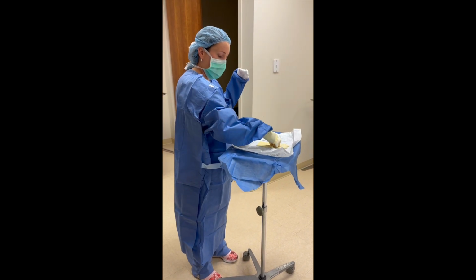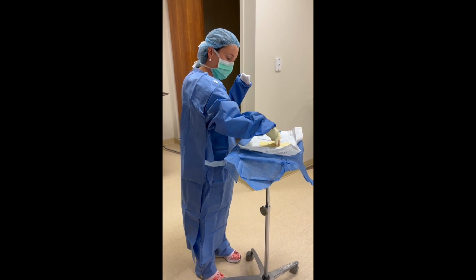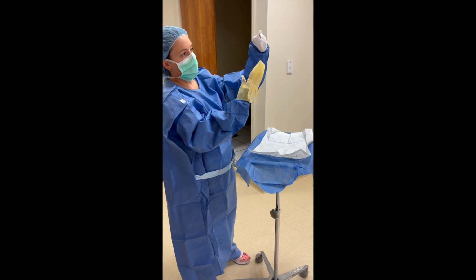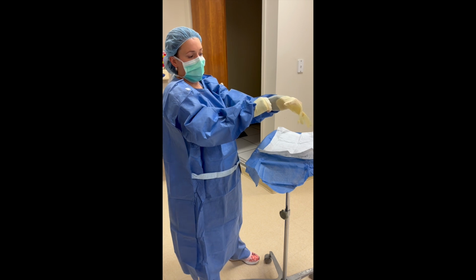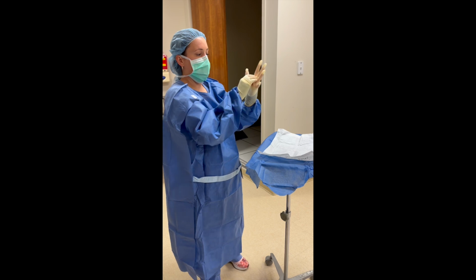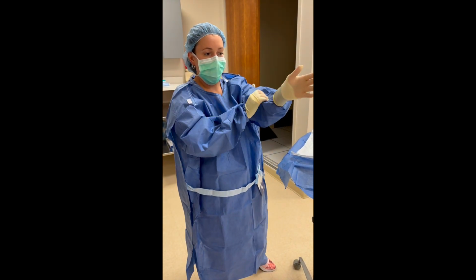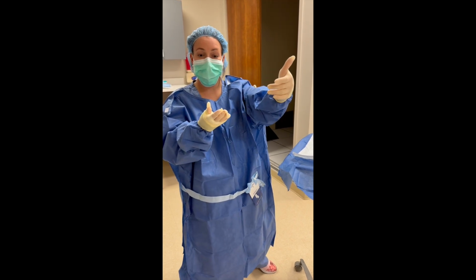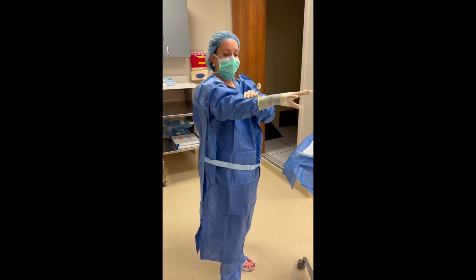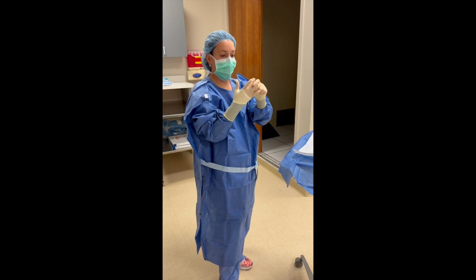So I put my fingers in the little cusp right here for the left glove, maybe. I take it just like so. I put my cuffs right here. Again, I kind of cheat and work my fingers out. And then I start to pull this back and I adjust my glove. And now I don't like my cuff on my hand, so I pull it back like a lot of people will do. But now this hand is free to finish this hand, okay? Because remember, this was all sterile. And sometimes if you don't get your hands dried good enough, the gloves really like to stick to them.